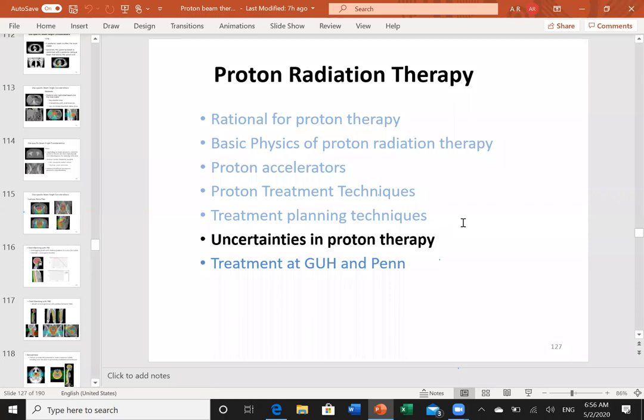The prostate is a very unique kind of, or very simple kind of anatomy. There are only two things in between the treatment plans, usually rectum and bladder, right? So there is a comparison between the IMRT as well as the IMPT. So it is comparable. But on the other disease sites, I think there is a lot of benefit with the proton. But still, yes, sir, it's not published yet.